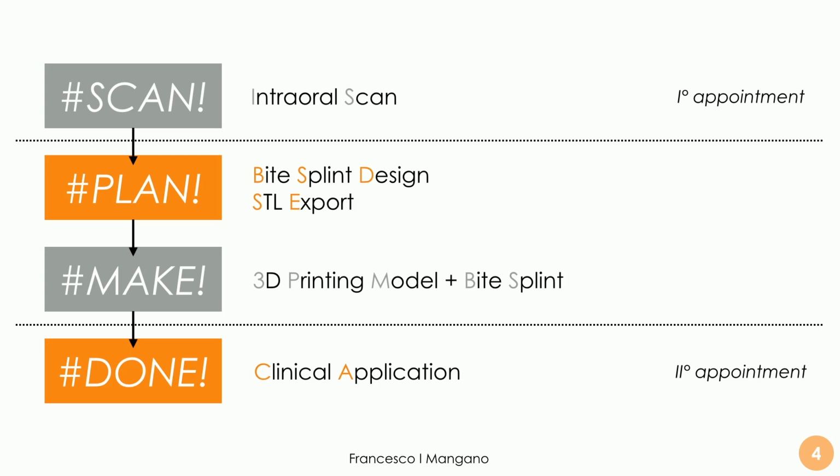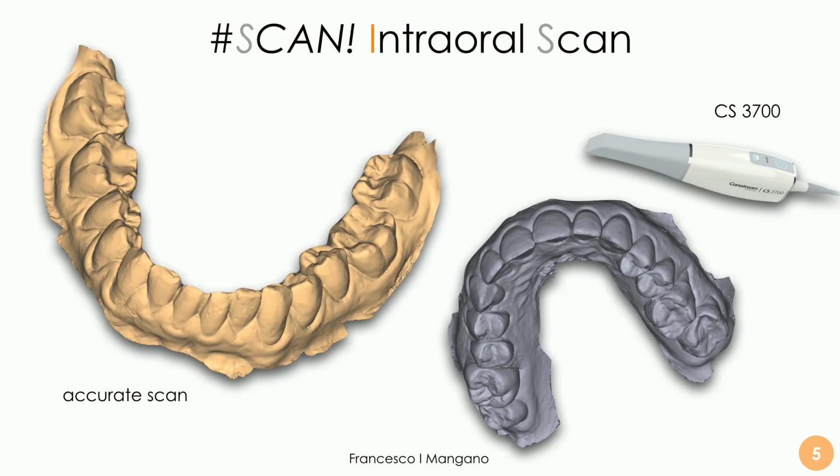So more or less the first appointment can take 30 minutes to 1 hour if we use the Mojo as well, but it's much better because we have individual information about the temporomandibular joints and the movement of the mandible of the patient. It's very good to functionalize the bite at best. Otherwise, in medium terms, we can avoid using the digital condylogram, but we need the intraoral scan. And this is how it works in a very simple case.